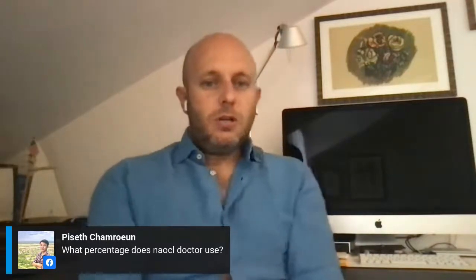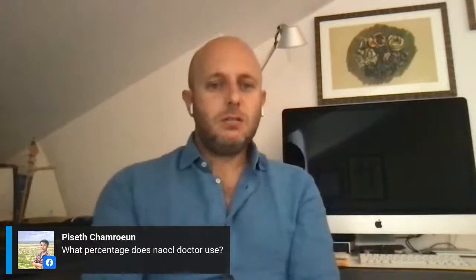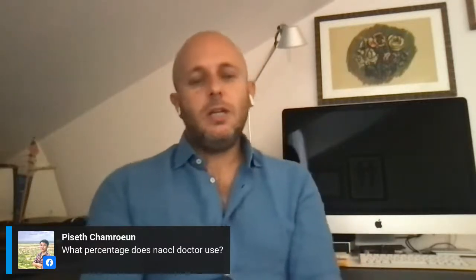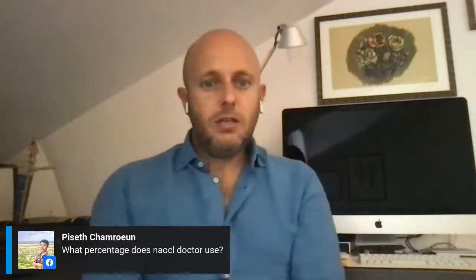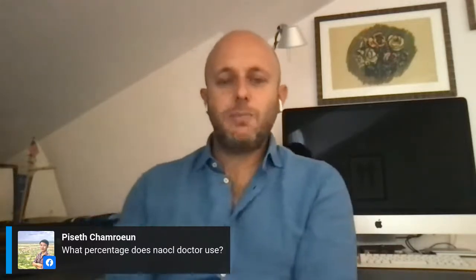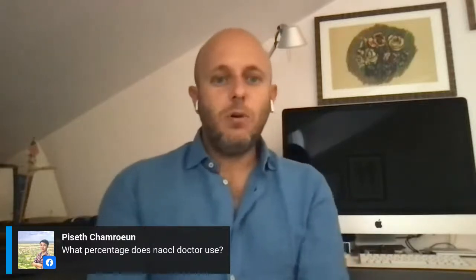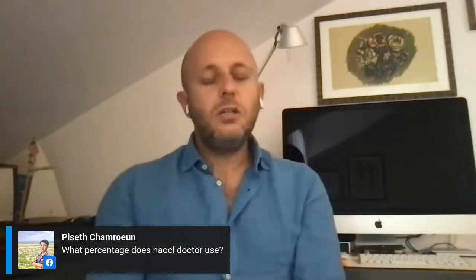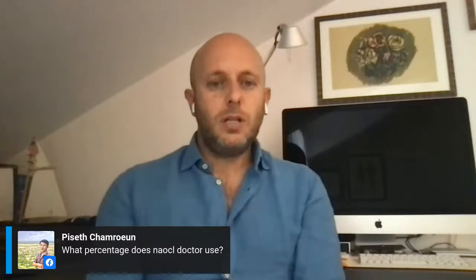The concentration of sodium hypochlorite, 5%. 5% is considered actually the best concentration. Here in Europe, in Italy, we also have at disposal a concentration of 6%, but on the market, concentrations of more than 6% are not available. I usually work with 5% sodium hypochlorite.